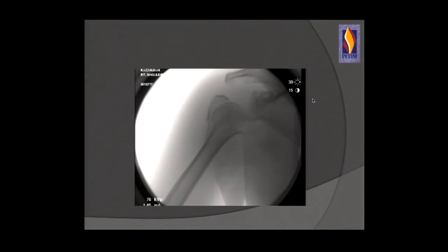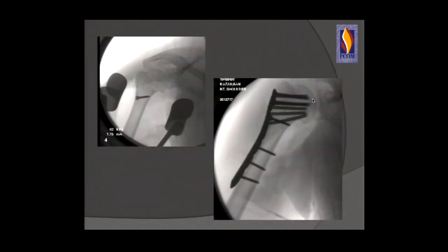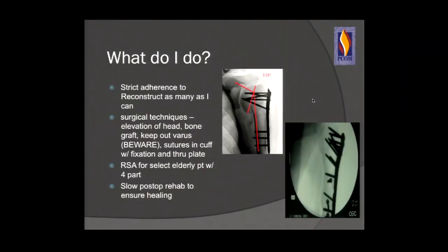Here's a two-week-old four-part proximal humerus fracture in a 52-year-old female. I elevated the head through the fracture plane, reduced the large greater tuberosity piece with a lag screw, placed bone graft under the defect, and applied a plate of appropriate length with good calcar screws to maintain neck shaft angle and sagittal alignment. I try to reconstruct as many as I can, use reverse arthroplasty for select elderly patients with three- and four-part fractures, and use slow post-op rehab to ensure healing in elderly patients.